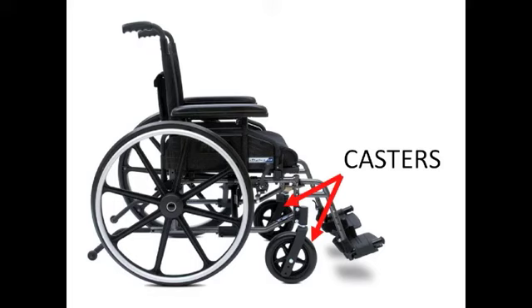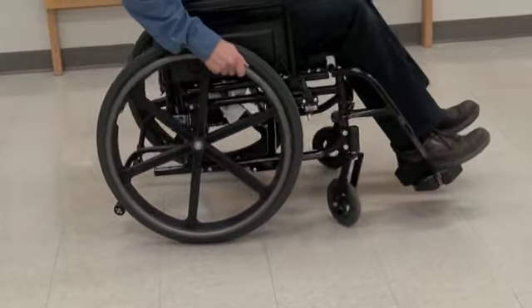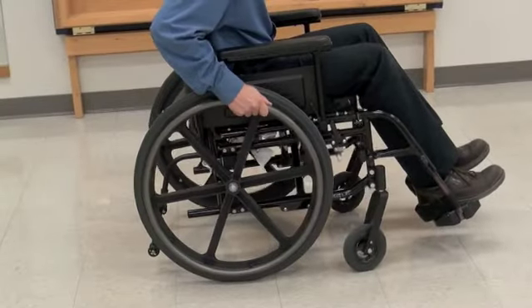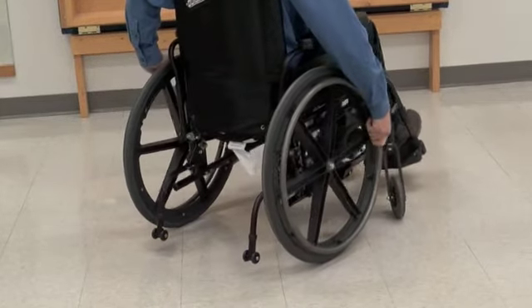The casters are the two small wheels located at the front of your wheelchair. There are important differences between casters and drive wheels besides the fact that they are smaller. The casters not only turn forward and backward like the drive wheels do, but they also pivot to the left or right like the wheels on a shopping cart. This makes the wheelchair more maneuverable.